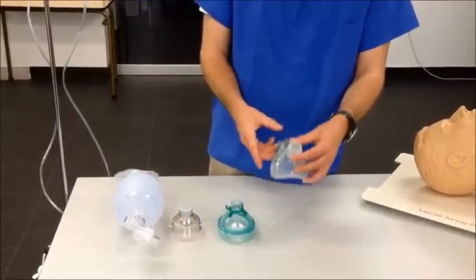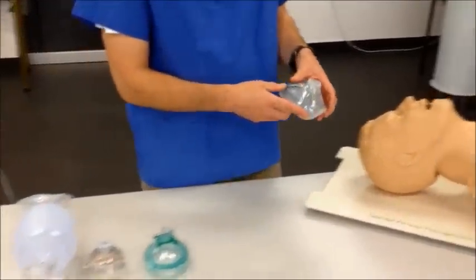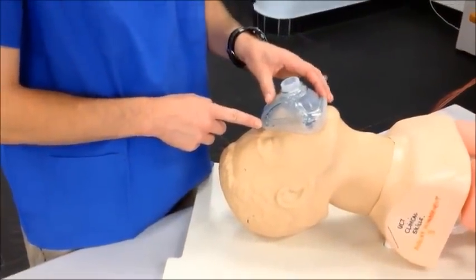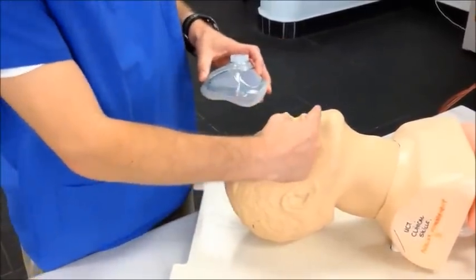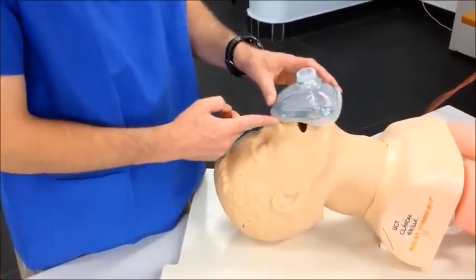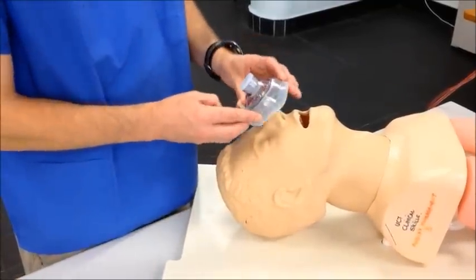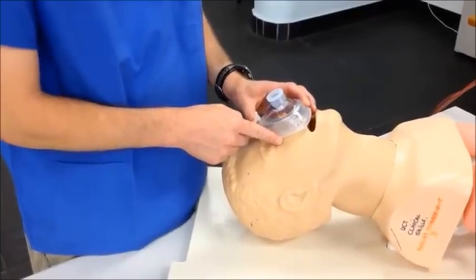The first step now would be to select the appropriate size for the patient. This is done by placing the narrow end of the mask at the bridge of the nose and then allowing it to lie on the face. If it is the correct size, the lower end of the mask will come to rest between the lower lip and the chin. A mask which is too large and overlaps the chin will result in an air leak, and a mask which is too small, when laid down, will not cover the mouth and therefore effective ventilation would be impossible.